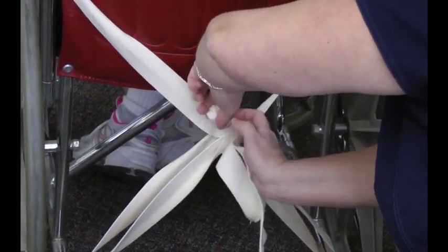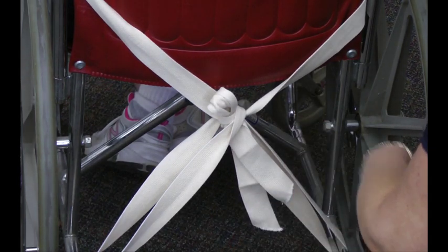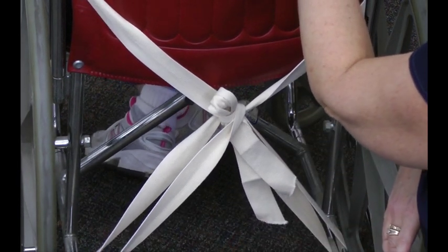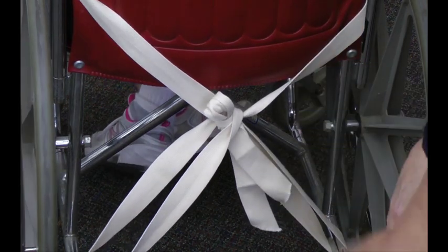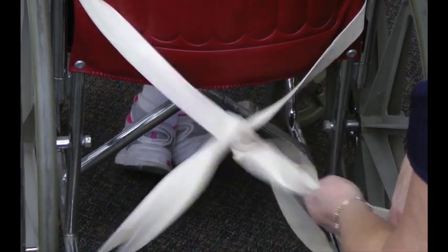Pulling it up. There we go. Okay, that's a slip knot. Go ahead and lean forward, Melissa. Would that keep you in your chair? Sure. Okay, again, you pull both of these. One pull, it has to release so we could get her up if there was a crisis or a problem.